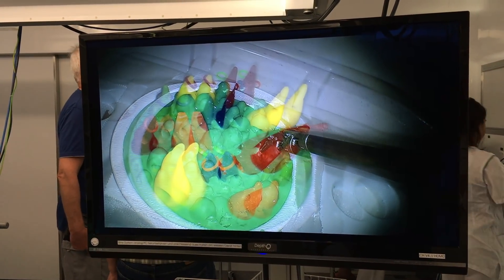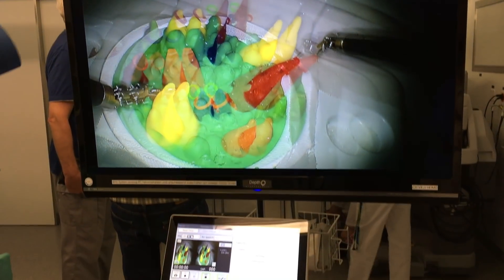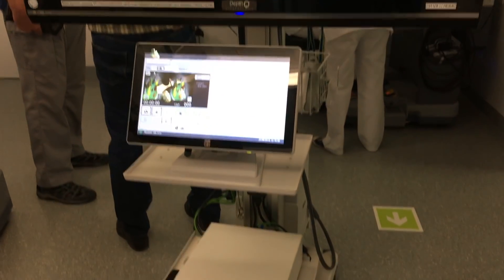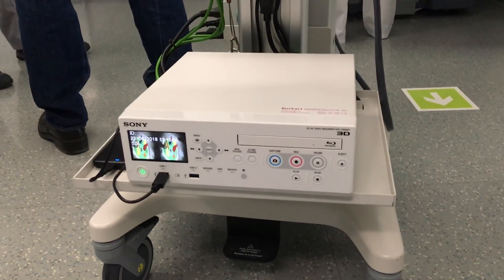Part of the system is also this large 3D screen for assistants or spectators, where you can see everything in 3D when you wear the glasses. And this is a 3D Blu-ray recorder.